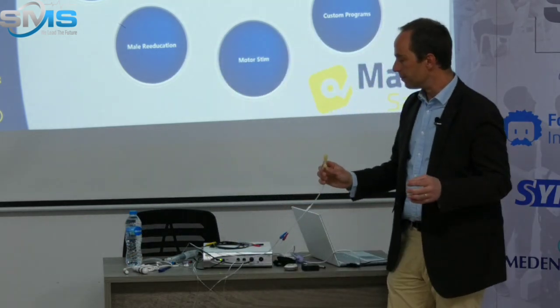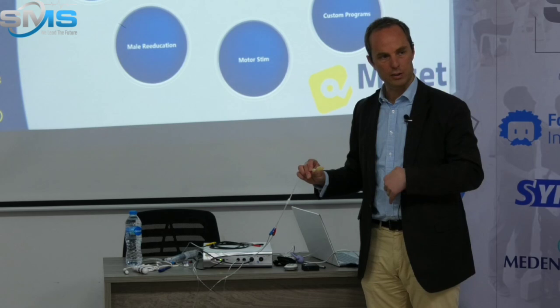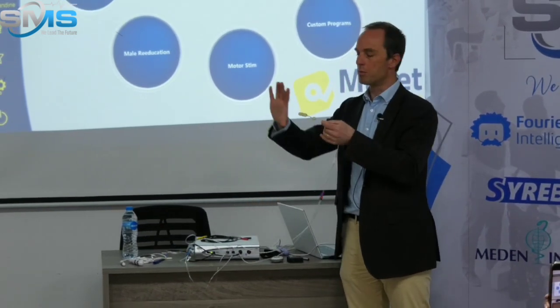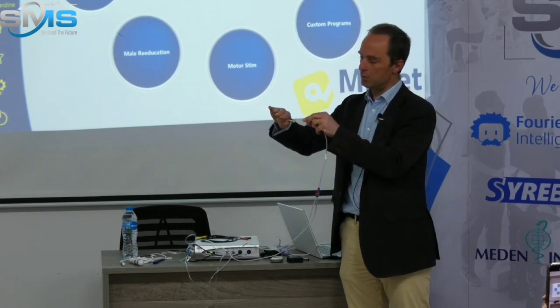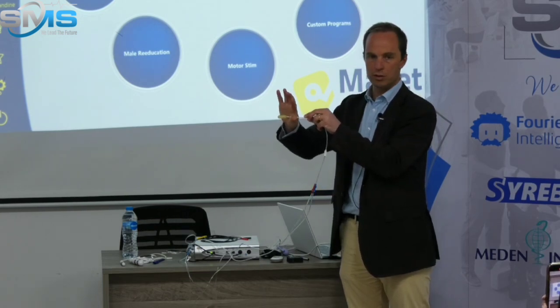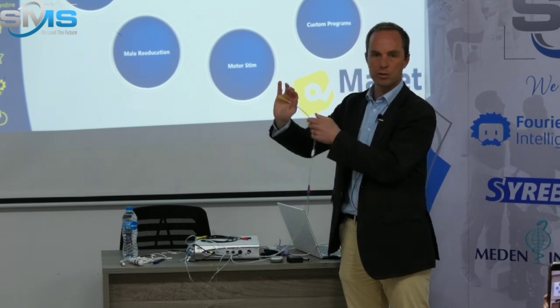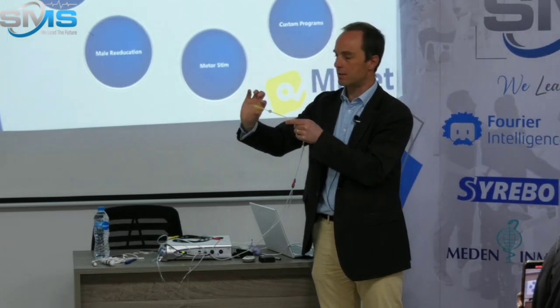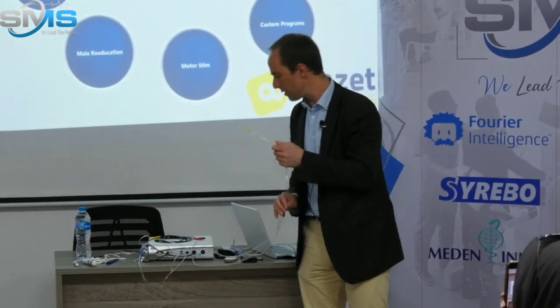But you can also have some anorectal problems. For those anorectal problems, usually the problem is between the pressure that you put inside your abdomen, on your rectum, and the work of the sphincter. So we'll use this kind of double balloon probe. These probes will be inserted inside the rectum, like this, and you keep just the small balloon on the sphincter. This balloon will be inside the rectum. And you can then monitor the pressure inside the rectum and work on the sphincter.